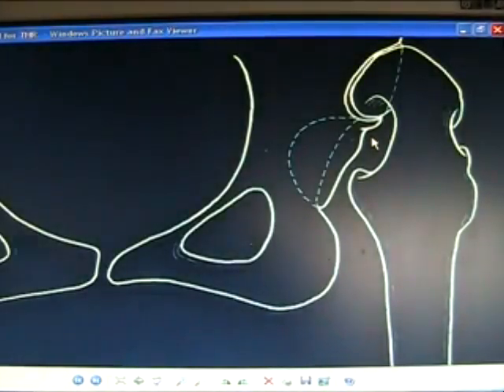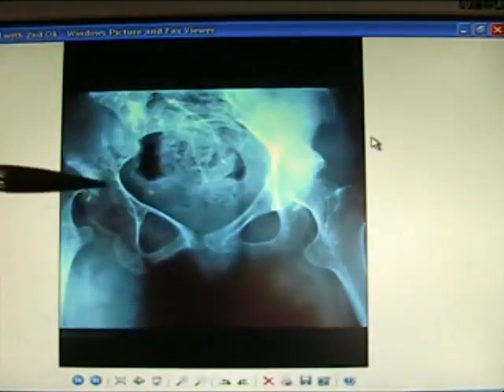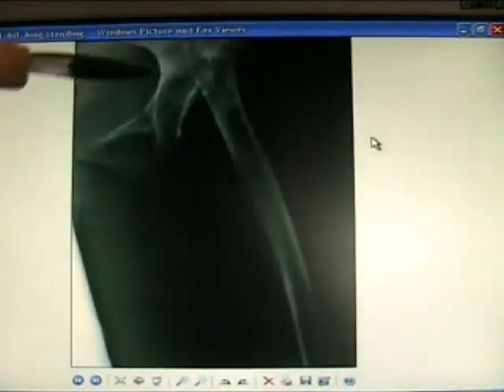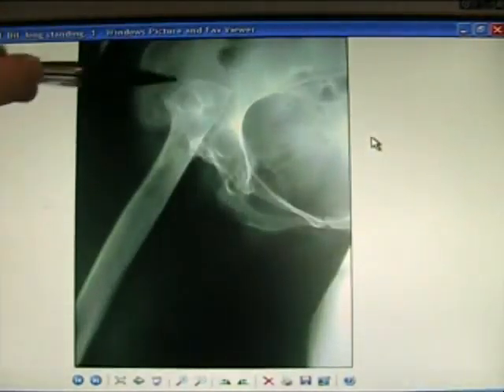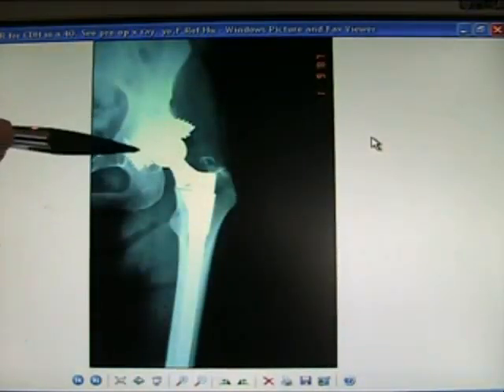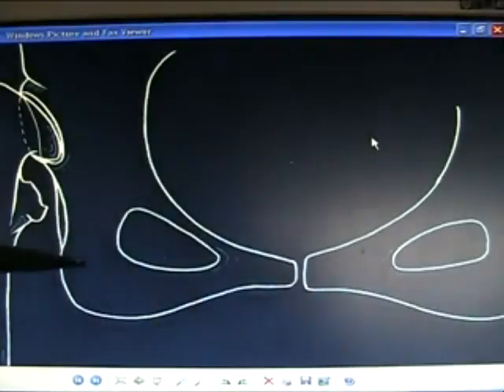Still got secondary OA. Bilateral CDH — very difficult surgery, but here it's very well done: total hip replaced, back in the true acetabulum.